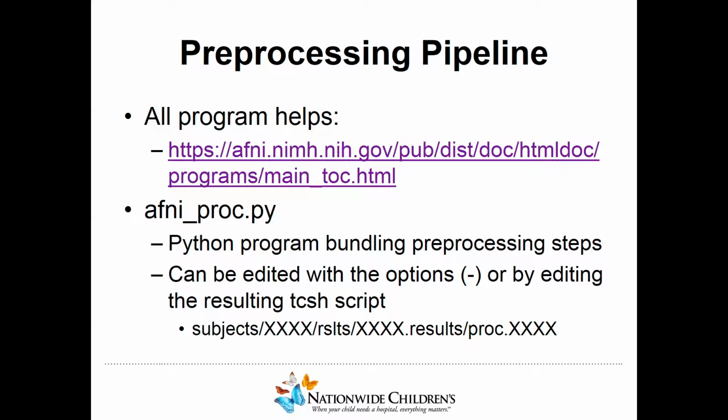Talking a little more broadly about AFNI ProcPy. Like I was saying before, this is a program or a script written in Python, and essentially what it does is it bundles all of the common commands used in pre-processing into a series of steps.